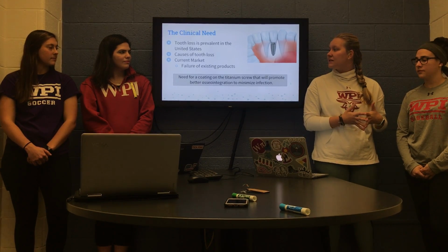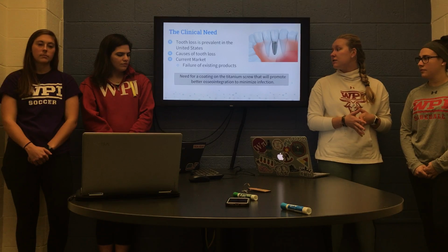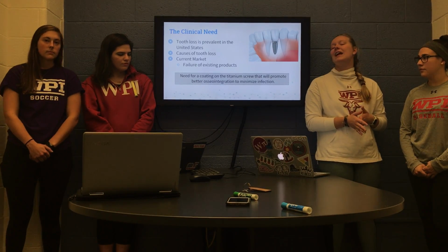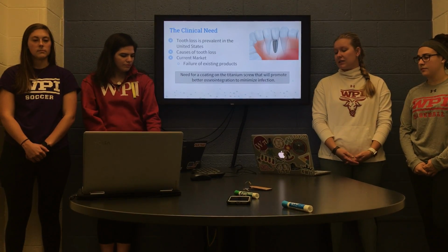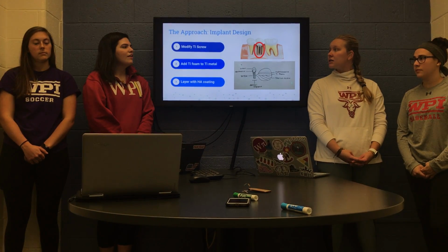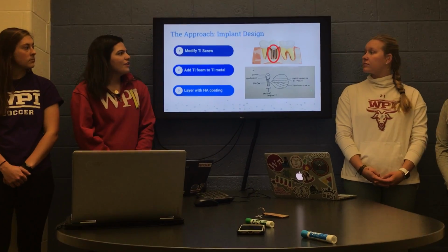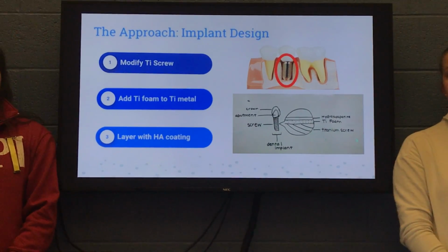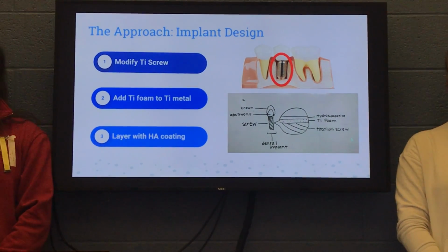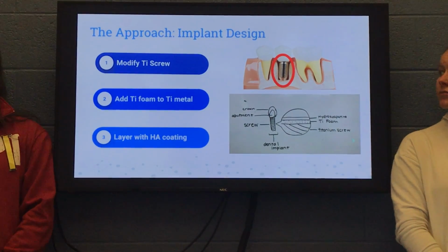So our group saw a need for a coating on the titanium screw that would promote osseointegration and to minimize infection. Our team is going to be focusing on redesigning the already existing titanium screw as shown in the picture on the right. First, we're going to modify the titanium screw. It already promotes osseointegration and there's no cytotoxicity, so it'll be a good base layer for our implant.